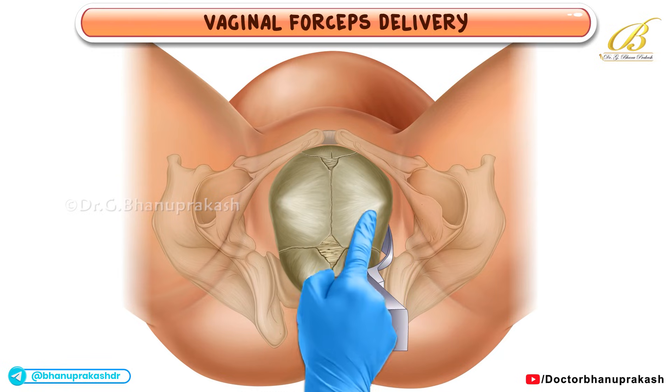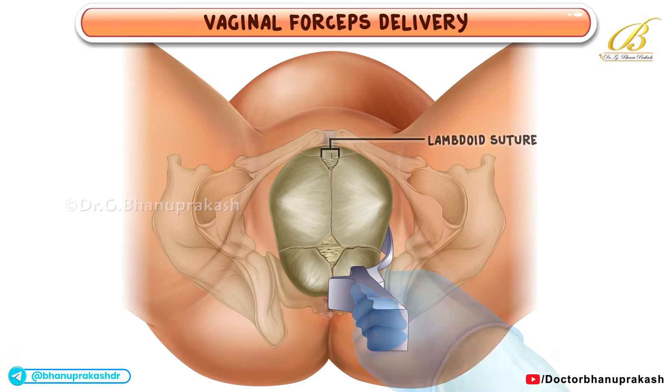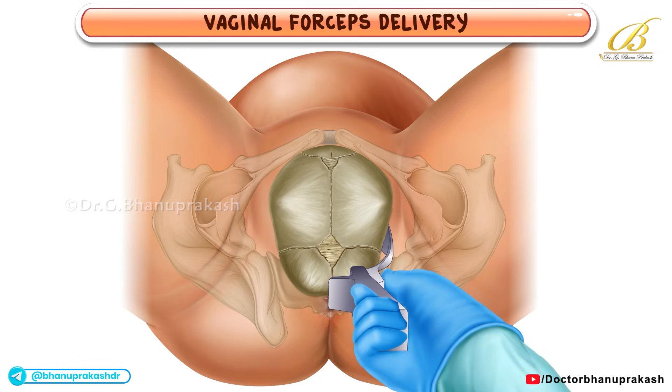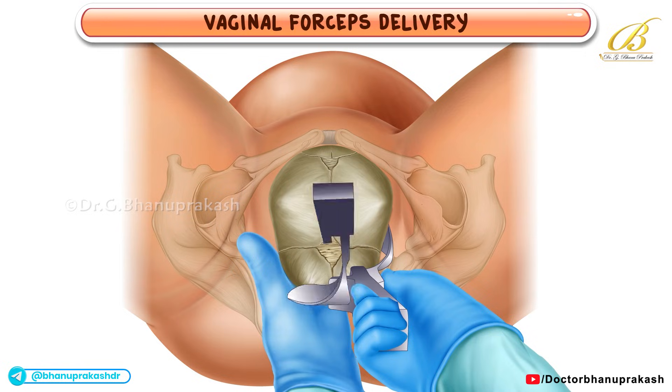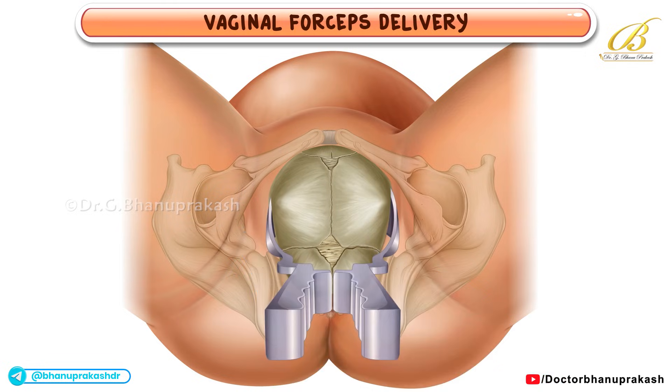The blade is positioned so that its upper edge lies just a finger's breadth away from the lambdoid suture. An assistant may hold this handle steady while the second blade is similarly inserted on the opposite side of the fetal head.